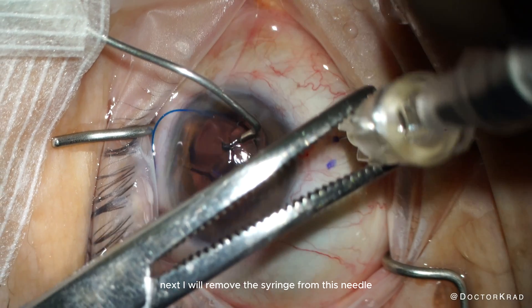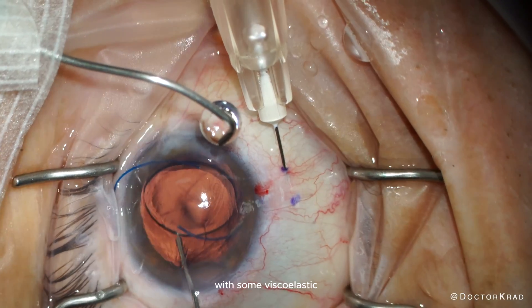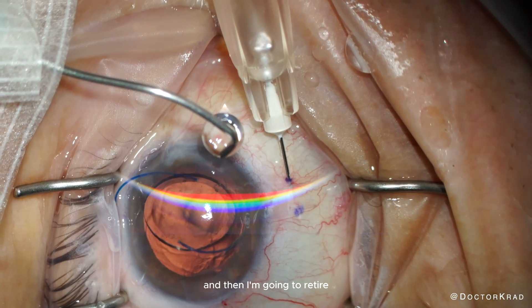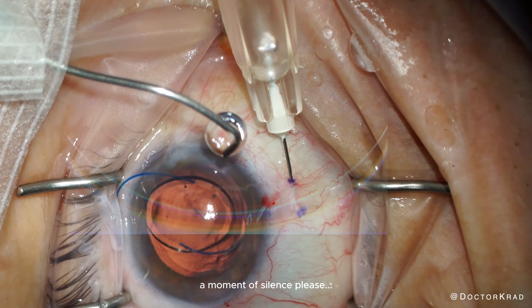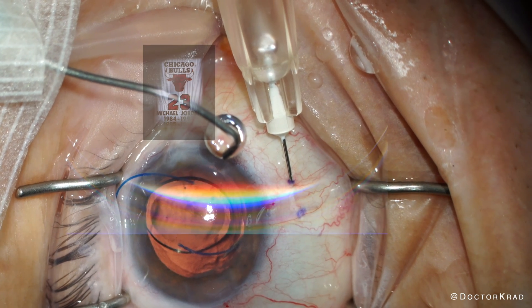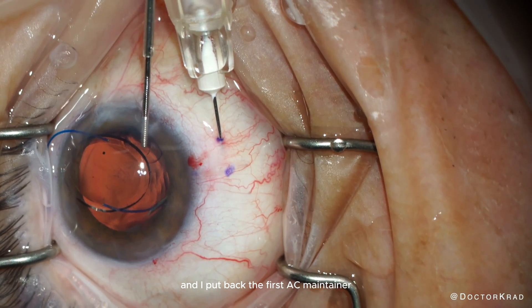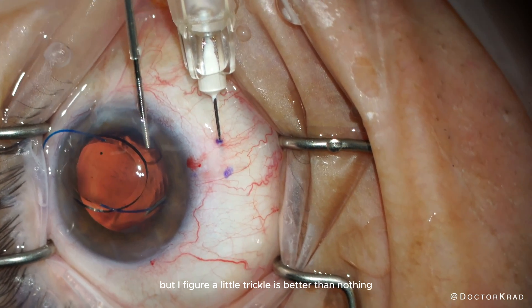Next, I remove the syringe from the needle. I reinflate the AC with some viscoelastic and then retire my makeshift AC maintainer — a moment of silence, please. I put back the first AC maintainer. We're almost done with the surgery, so I might not even need it, but a little trickle is better than nothing.